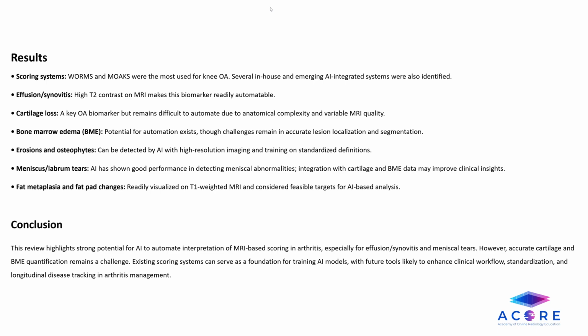AI can automate select MRI biomarkers in arthritis, including effusion and meniscal tears. Existing scoring systems provide a valuable framework for AI development and standardization across models. Although cartilage loss and bone marrow edema require further refinement for reliable automation, being able to automate different aspects of MRI quantification prior to that can help in this process of making these more reliable. In addition, high-resolution MRI sequences enhance AI performance in osteophyte and erosion detection, and AI can improve diagnostic consistency, enable large-scale analysis, and support personalized arthritis care.